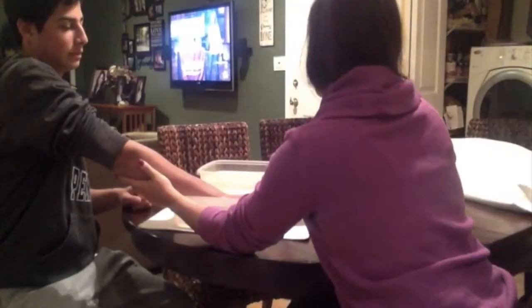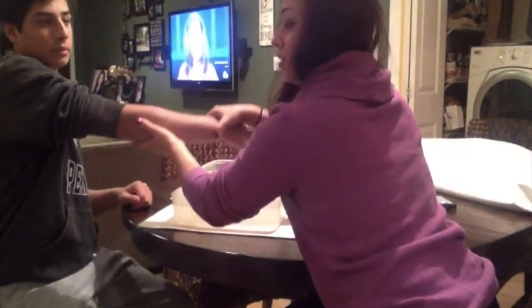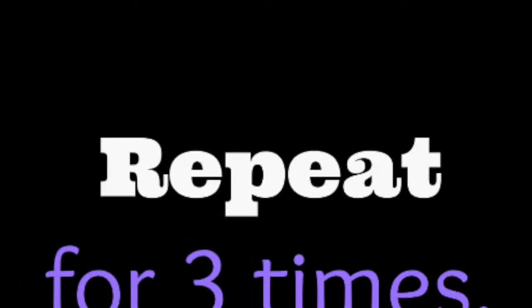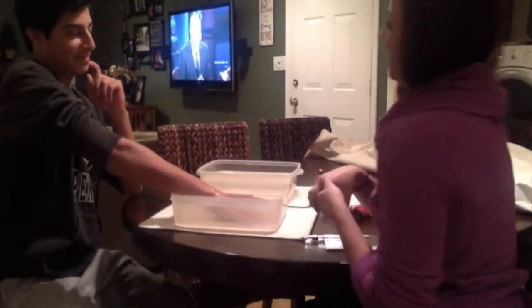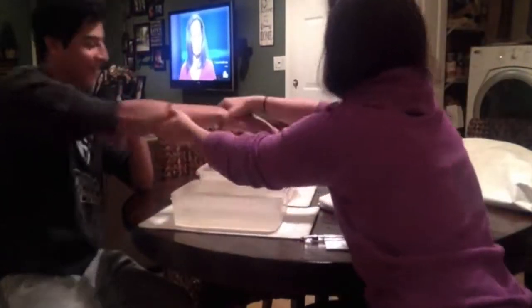Make sure that you have a timer handy in order to measure out the time between the contrast baths. Depending on the injury of your client, they may need assistance transferring their hand from one bath to the other. You are there for the client in order to make this process as easy and comfortable as possible.